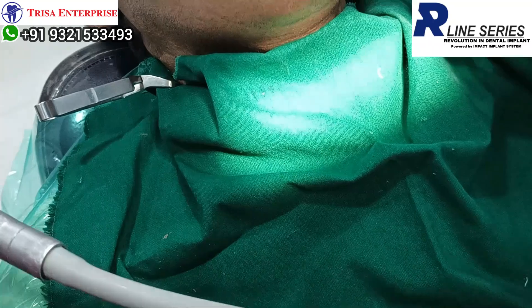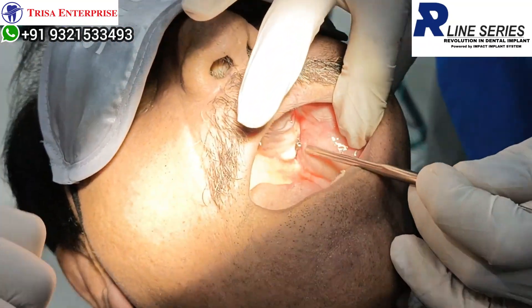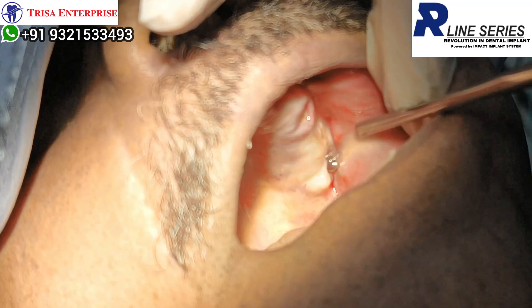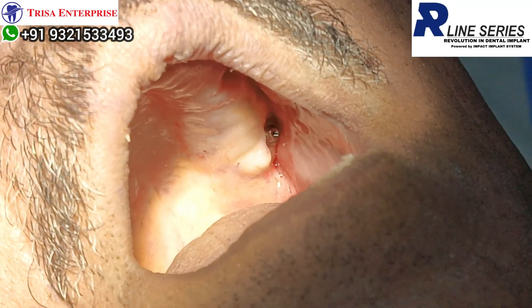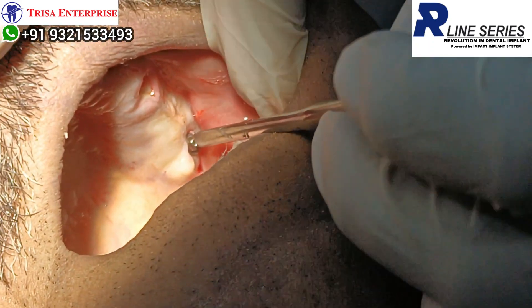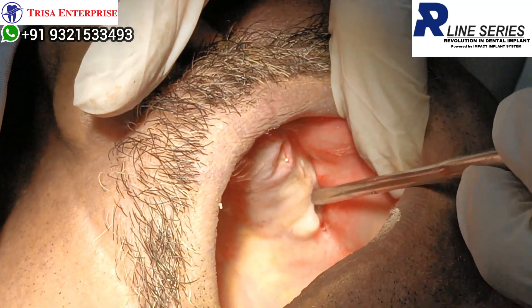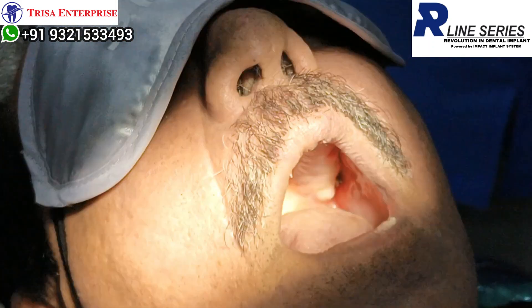I now have a nice screw-retained implant in the pterygoid. To confirm the implant is well-placed: first, by the torque I was getting on the hand; second, when I tap on the implant, you hear this sharp note. These are two clinical indications that the implant is in good bone.